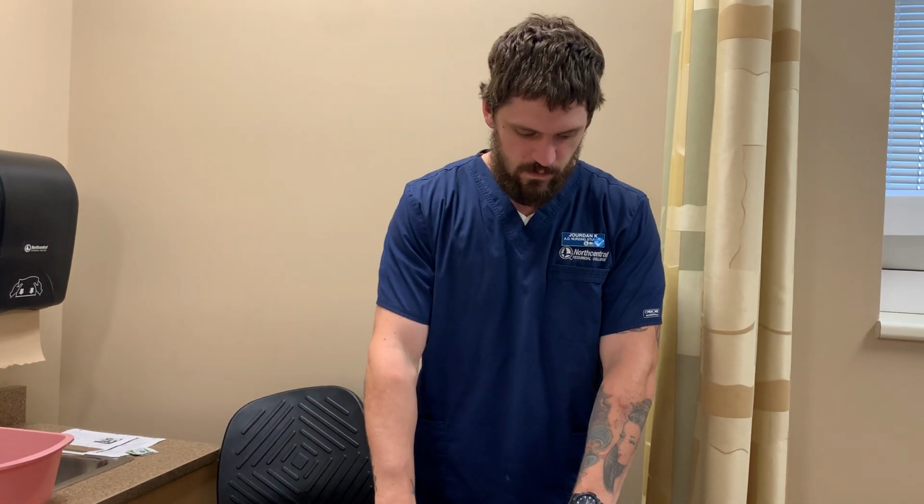Hi, my name is Jordan, and today I am going to demonstrate how to give an IV push med through a central line, more specifically a PICC line today. So, first thing we're going to do, we are going to check our order.